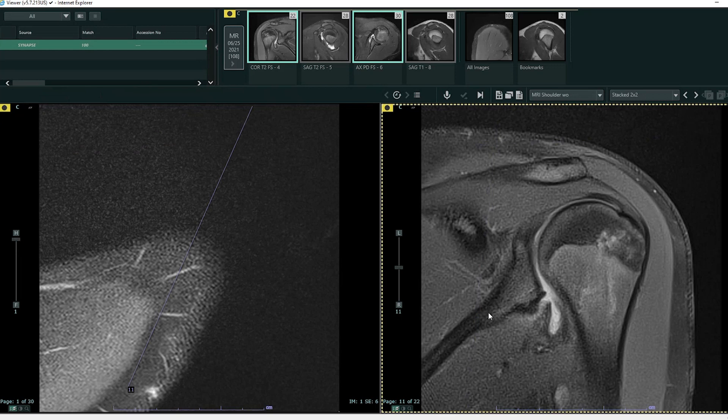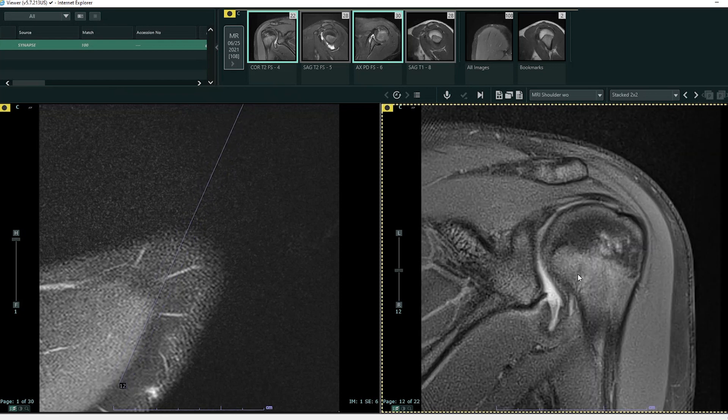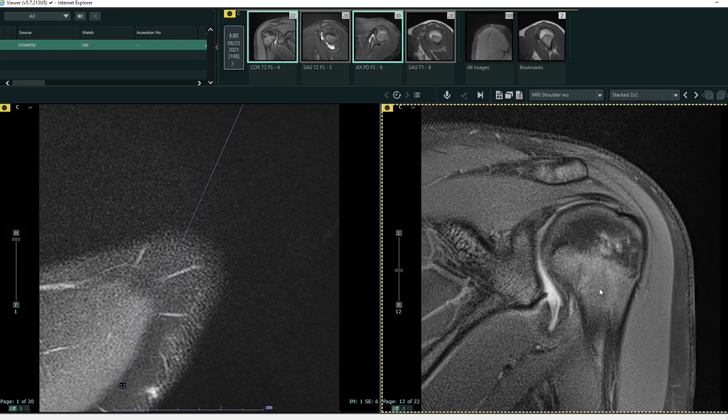So this is a coronal fluid-sensitive sequence. Superior is towards the patient's head, inferior is towards the patient's feet, lateral is the outside of the image, and medial is heading towards the patient's chest. This is the humeral head — the top of your shoulder or arm — with the head and shaft of the bone visible. This is the glenoid, so think of this as a ball-and-socket joint, this being the ball and this being the socket. There are a few other structures which help keep this in place: we have the joint capsule, and we also have the rotator cuff tendons.